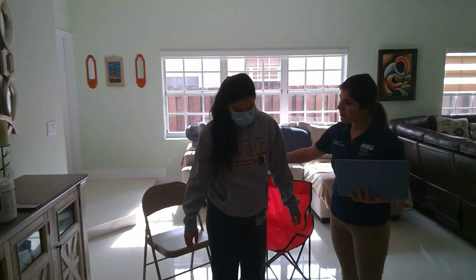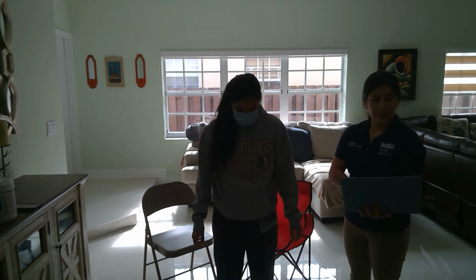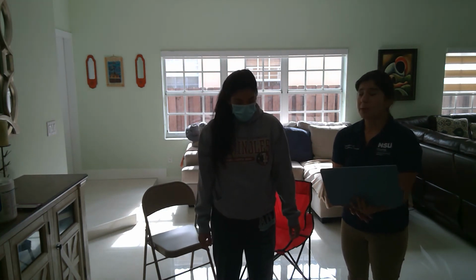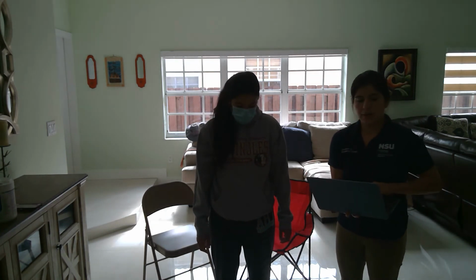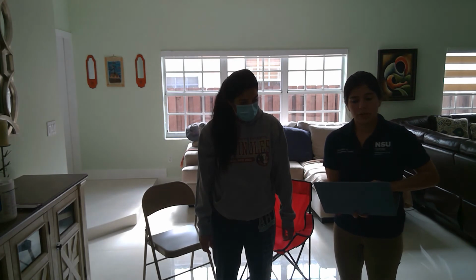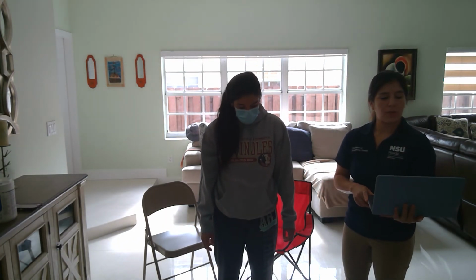My legs are getting a little tired. Are we almost done? A little tired. We are almost done. Okay. We have 3 more items. Do you need to sit down and take a break? No, let's finish. Okay. So we are going to place alternate foot on step stool while standing.